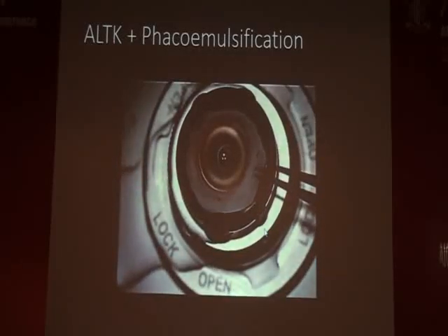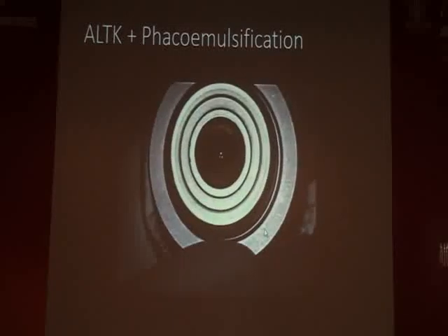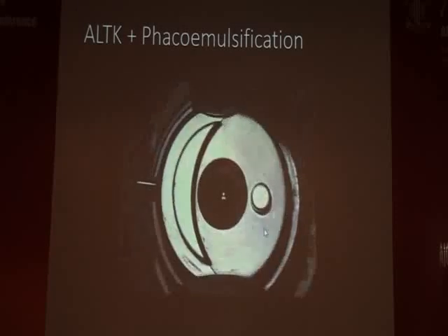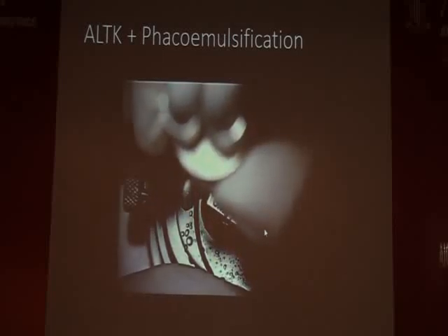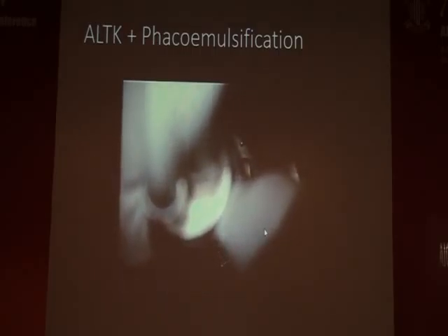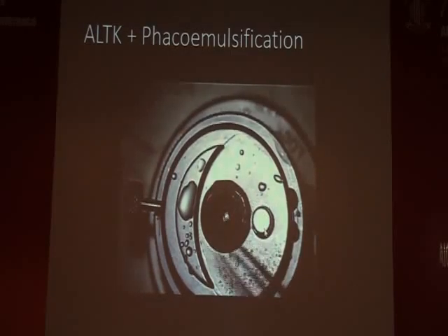And this is the Moria microkeratome. The corneoscleral rim is taken, and the corneoscleral button is placed centrally on the Moria microkeratome. This is followed by the cap, which is then placed over it, and followed by the suction ring, which is then applied on this. The screw of the cap is tightened so as to elevate the entire corneoscleral rim upwards. And again, the microkeratome head, which is 350 microns, is being used to fashion the donor lenticule.